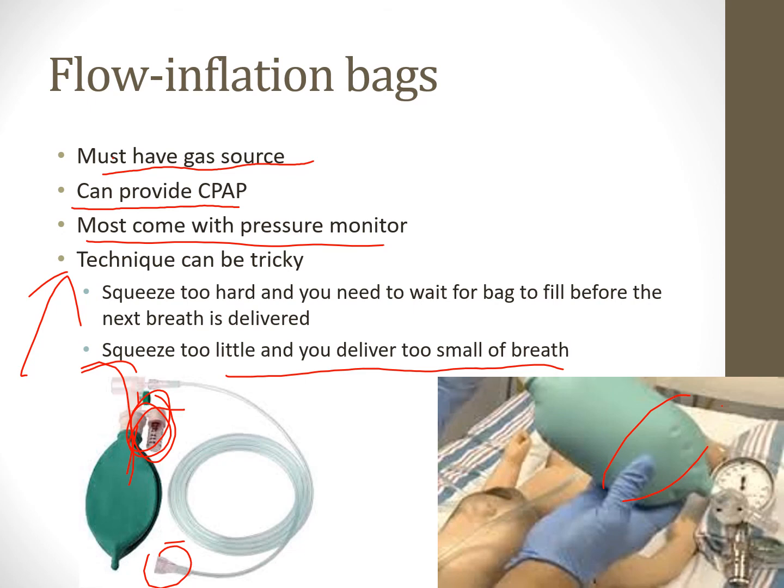So your technique and your skill has to be good with this, and I want you guys to practice with this in the lab. Make sure you write a note to yourself. Make a little list of things I want to practice in lab, skills I want to develop in lab, right? And this should be on there. Flow inflation bags should be on there, especially with oral airways, nasal airways, flow inflation bags, and self-inflation bags. Make sure all those are on there.